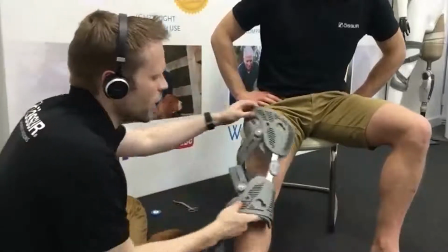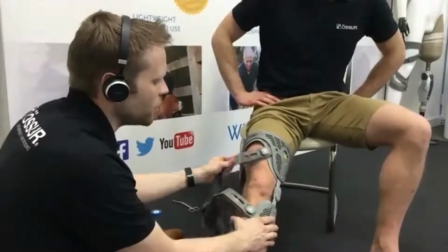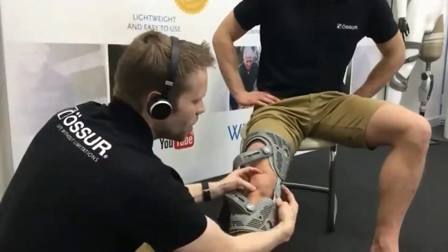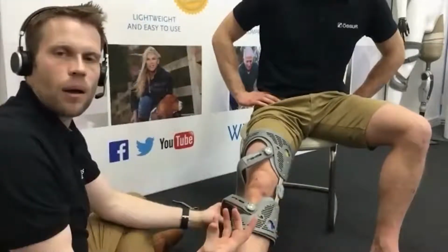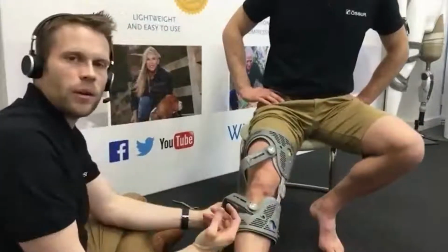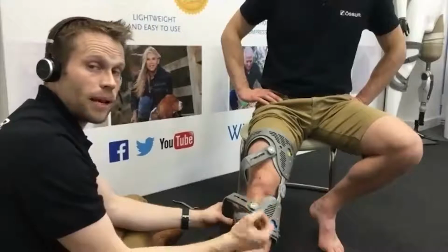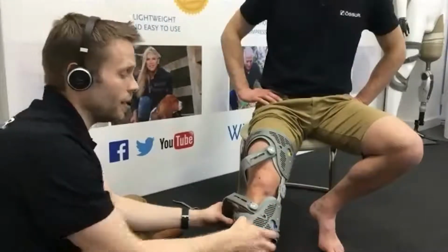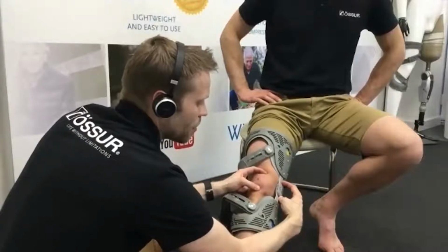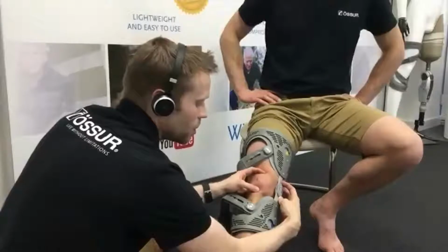We're placing the frame on and into position, and what we need to do is just make sure that we've got the hinge position correctly. One of the key areas that patients often have problems is making sure that we've got that in the correct position. Hinge position is probably the cause of sort of 80 to 90% of the problems that we might see. So really making sure that we've got this lined up level with the kneecap and halfway between the front and the back of the knee is really, really important.